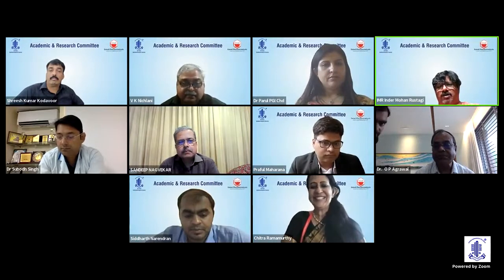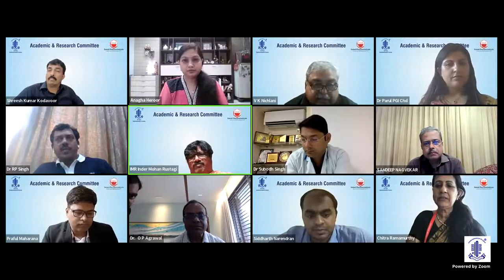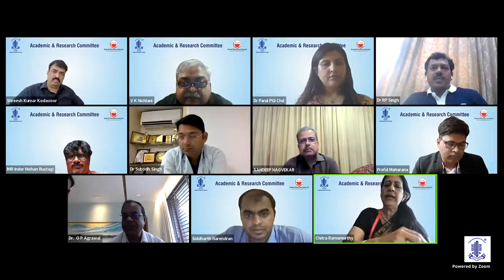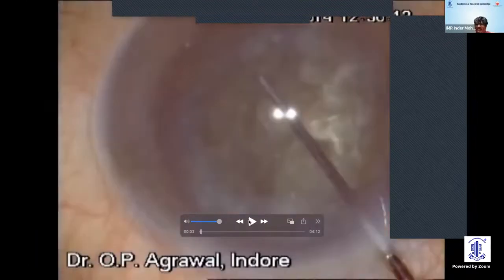Doctor, one question, please. If you would have put the lens in the bag, what are the chances of capsular bag phimosis later on? No, you could aim for a larger rhexis, as Dr. R.P. Singh was saying. Go behind the iris and do it, and make it significantly large, not too large, but let it not be too small, because phimosis is a challenge in this. Yes, very valid point. Thank you, Doctor.